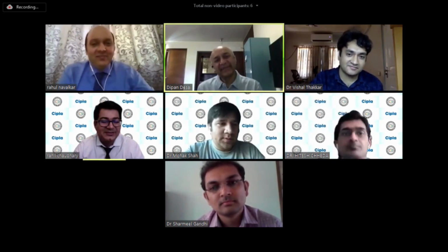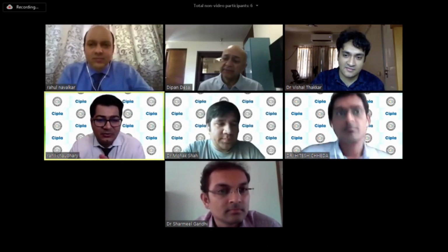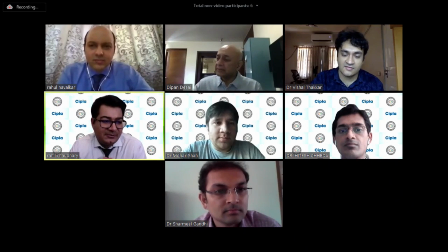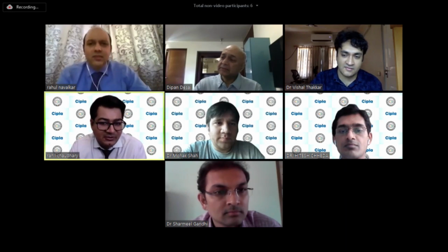Right. Just one question to the panelists, may I? Yes, of course. Is anybody trying to incorporate the parallax effect if they are using the Varion? Maybe if initially the microscope is at a tilt, once you finalize, just like Isa mentioned, that we should go in with the 30 gauge needle and fine tune the final position of the lens. So is anyone at the end of the surgery trying to incorporate the parallax effect that may cause a slight degree error?